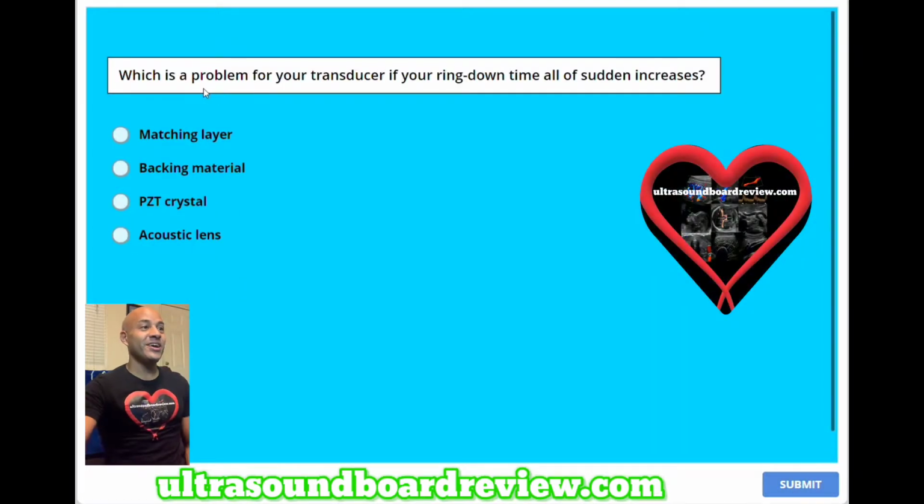Question 1. Which is a problem for your transducer if your ring down time all of a sudden increases? A. Matching layer. B. Backing material. C. PZT crystal. Or D. Acoustic lens. The answer is B. Backing material.